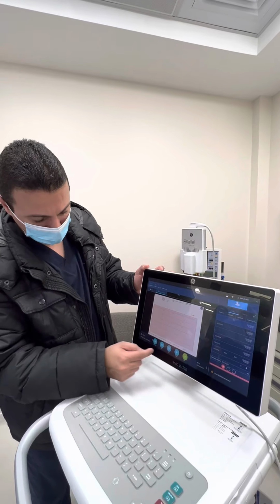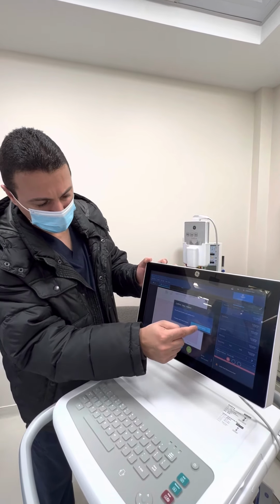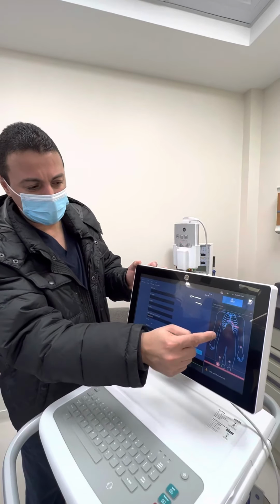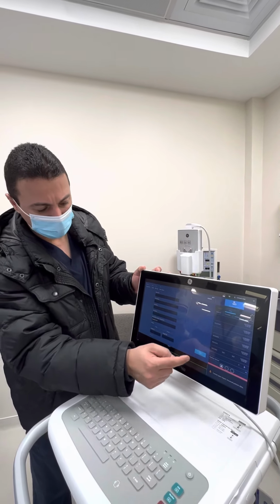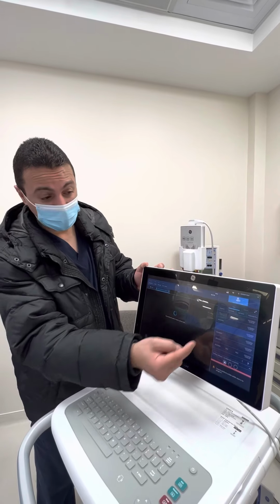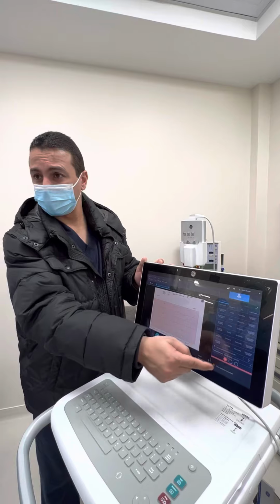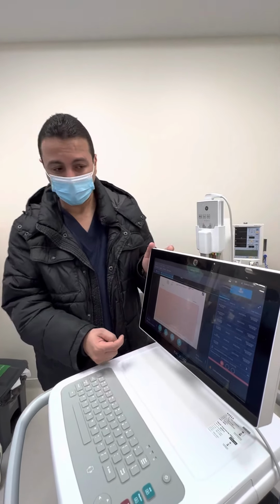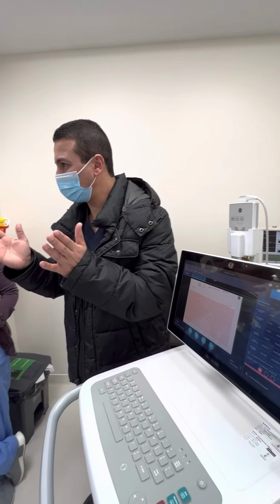Okay? Yeah. So we'll say done, new patient. So we said if we have the files here, I will get back to my patient in the files, then I will go to my patient, I will go to the orders, I will attach the order to it, then I will do transmit. Okay? Any further question? Easy, right?